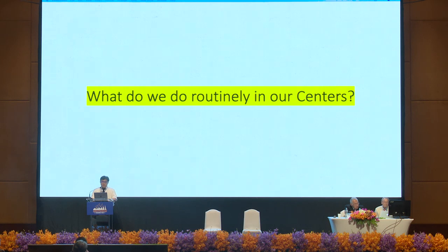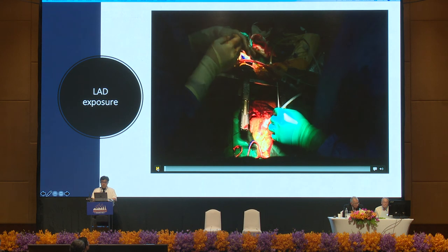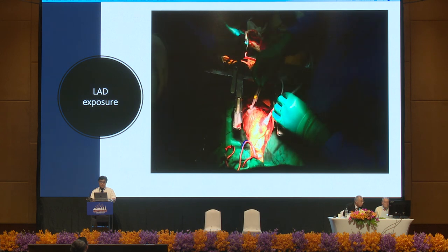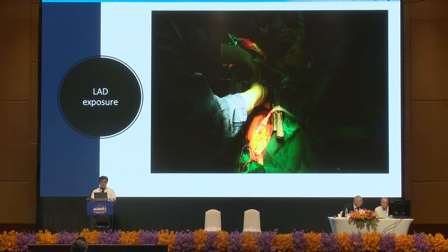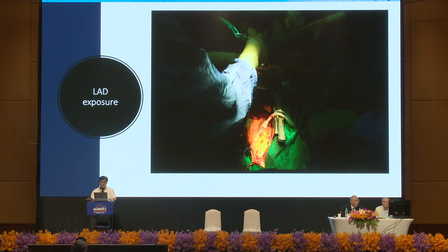Before we came into this, what did we do routinely? Actually, in our hospital, we have four attending surgeons, and up to now, all four of our cardiac surgeons perform off-pump. So not just me. We do it routinely every day. With this practice, this is a little show of the environment in our operating theater. This is the way we expose the LAD. We do it like we do every day, like we eat lunch, I think. No rush, and the team is quite set up now, so I'm happy about this.